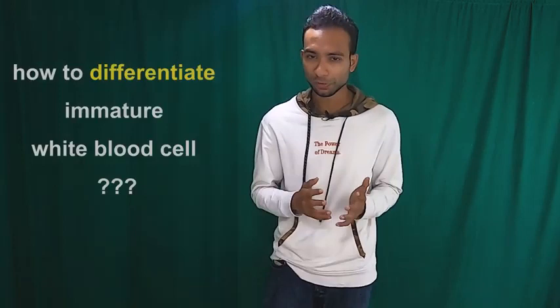When we consider the size of the cells, promyelocytes are the biggest cells, then myeloblast, myelocyte, metamyelocyte, and stab forms or band neutrophils are the smaller cells. Finally, these cells give rise to mature granulocytes.